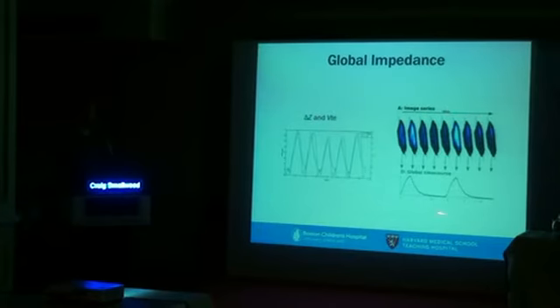And this is essentially a similar image. So we see the global impedance. Now we're only looking at two big breaths here, but you can see the snapshots, what those images look like at each one of those time points. So at peak deflation, before the first breath is initiated, we see there's not a whole lot of change in ventilation here. Patient breathes in, get another image, and you can see it's much wider. There's a lot more increase in impedance, and then we can say ventilation. And that's essentially what it looks like.